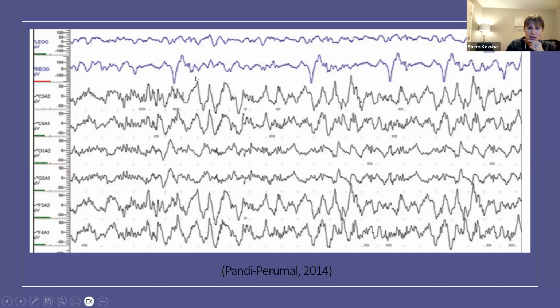So you can see here the eyes. You can see how much this delta activity, these deep frequencies of waves, are moving into the eye electrodes as well. It's really cool actually to see that. Sometimes we get a little bit of artifact that happens here too. These may even have a cardiac sort of origin to them. It's hard to say unless I have the rest of the leads, because all I'm getting here is just the brain activity in this particular one. But this is a lot of growth hormone happening here.